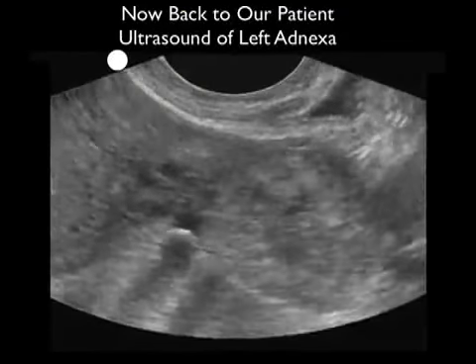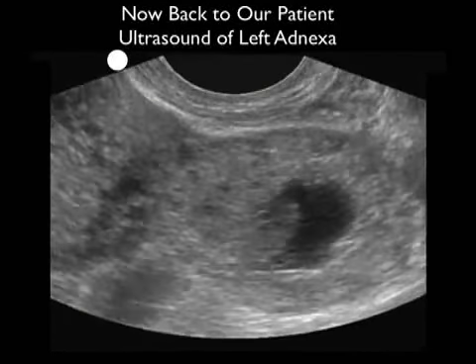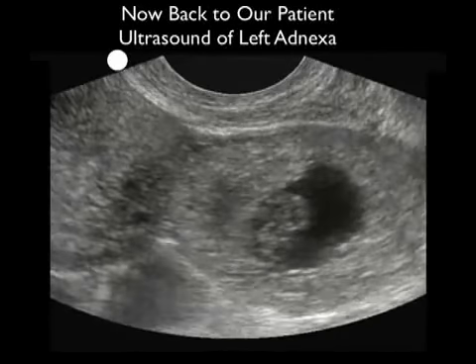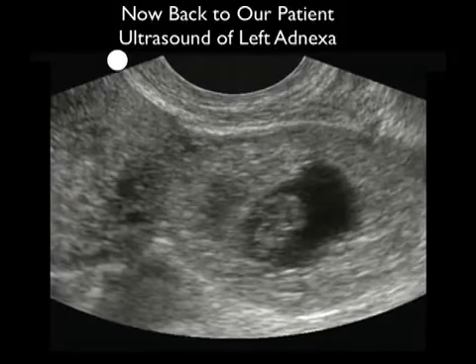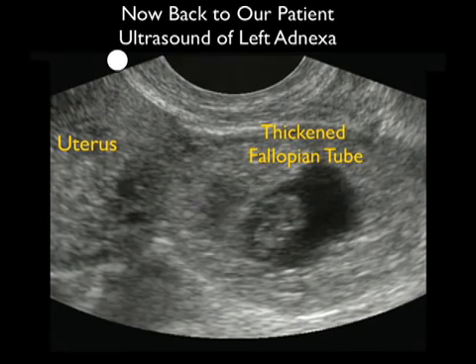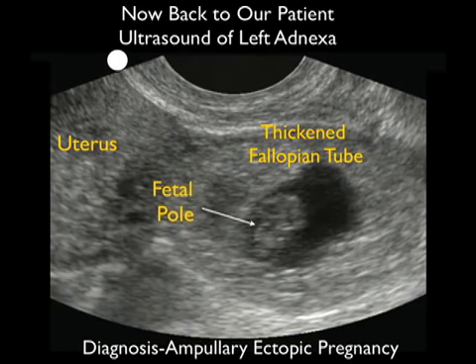Returning to our case, given the presence of a positive pregnancy test and the absence of an IUP on bedside ultrasound, we were very concerned about ectopic pregnancy and decided to scan out to the left adnexa. Here, notice we're scanning out to the left adnexa and we have a positive finding. What we see is a thickened fallopian tube comprising what is known as the bagel sign. And notice within the thickened fallopian tube we have another positive finding — the presence of a fetal pole. So in this patient, we were able to diagnose an ampullary ectopic pregnancy, and our next move was to call OB-GYN STAT for a consultation.